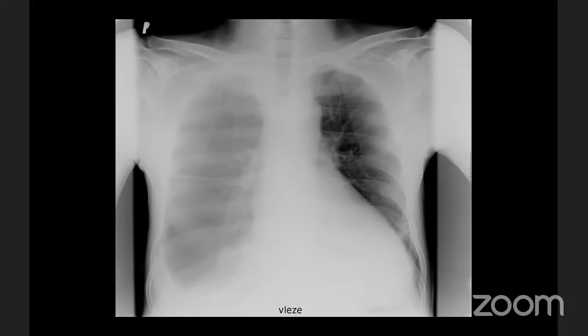But imagine that you are an internal medicine doctor, and someone wrote to you that there is an enlargement of the heart. What does it tell you? Even if I said there is probably left-sided enlargement, this heart shape is usual for aortic valve problems or something, you still need to do echocardiography for a diagnosis. If I tell you just that it's enlarged, you need much more information from history and physical examination, and you would definitely do echocardiography. So the information is actually not that important. It is important to say the heart is definitely not healthy, the size is enlarged, but it also depends how old this patient is. If this were a 20 or 30-year-old patient, I would say this is pathological and send him to cardiology to look for the problem. If this patient were 90, I would say this is just normal at this age. Okay.